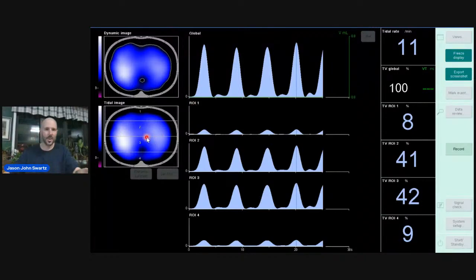I'm going to have to take another snapshot because when you press the reference up here, your reference shows up there. From there, it's locked there unless you change the reference, and everything else is compared to that, because you're able to scroll down this time axis with all the things you've done over the last 5 minutes, hour, 3 hours, whole shift. It's all there, and you don't have to remember. If you're not connected with a Draeger product, you can still use this, but you'll have to mark events. You'll have to have a paper just to remember A, B, C. It's not going to give a numerical value.